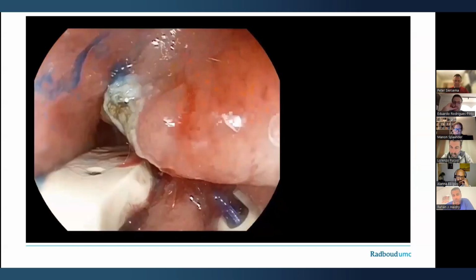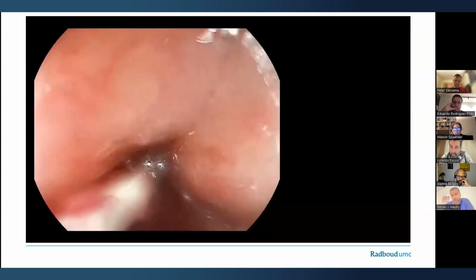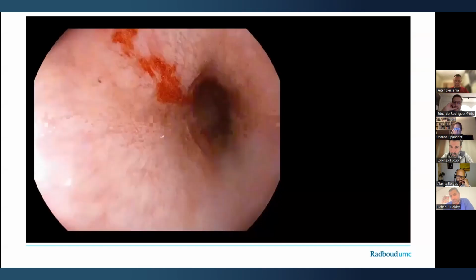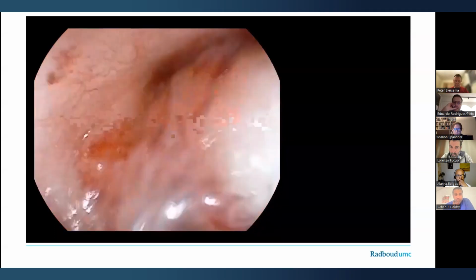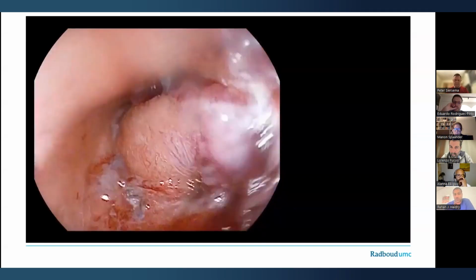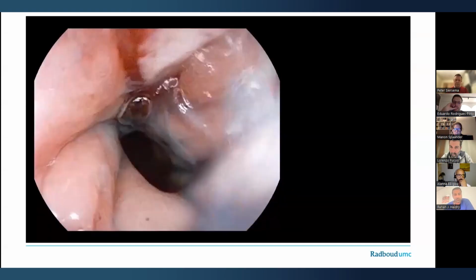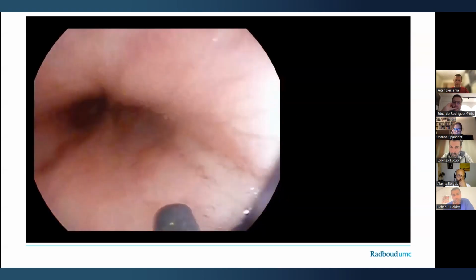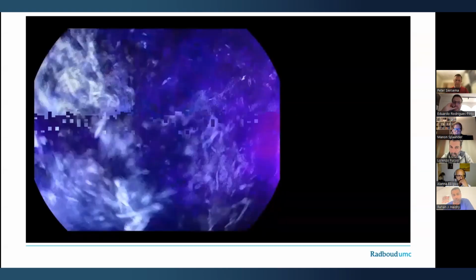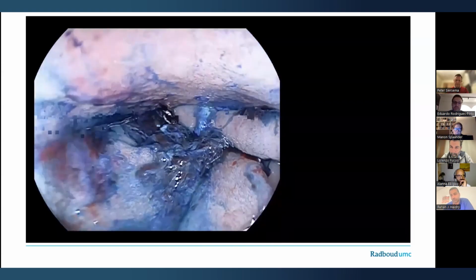And the important thing here also is not to put too much tension on these sutures, because the tissue will come together from mucosal healing, from the APC and from the disruption. And invariably you will create a slight stenosis here, which is really, in the bigger scheme of things, not a big issue. And then you can see here on the final pass, the defect is closed, and on this pass of the methylene blue, there was almost no dye coming out of the intercostal drains.